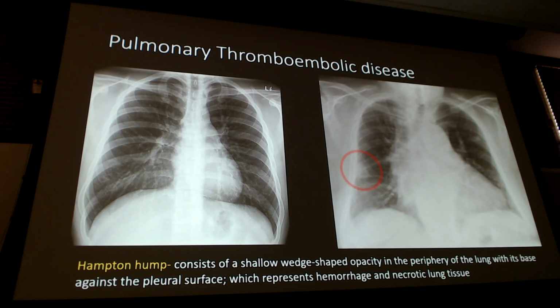If I already have necrotic tissue to the point where I'm starting to show up on radiologic images, they probably have a small peripheral pulmonary embolism sitting down in here. It's not centralized. It wasn't causing a whole lot of symptoms until it got to the point now where they're just like, I keep being short of breath with activity. You get the X-ray just to see the X-ray, and you got this thing here, and you're like, okay, well, maybe you have a PE there. Yeah, good job on the cardiomegaly.